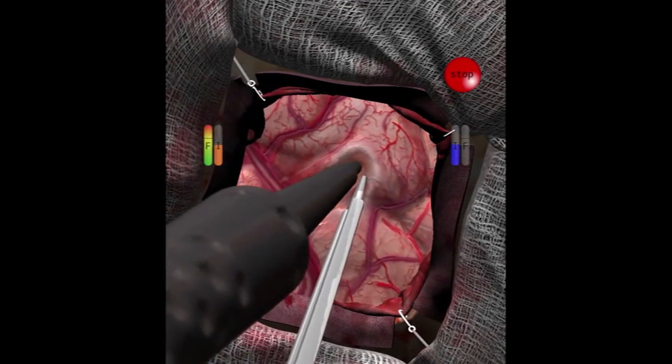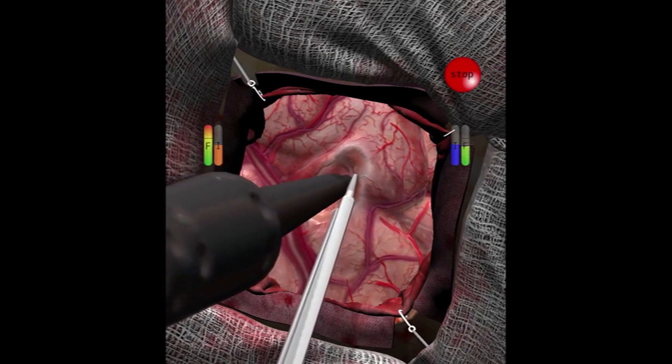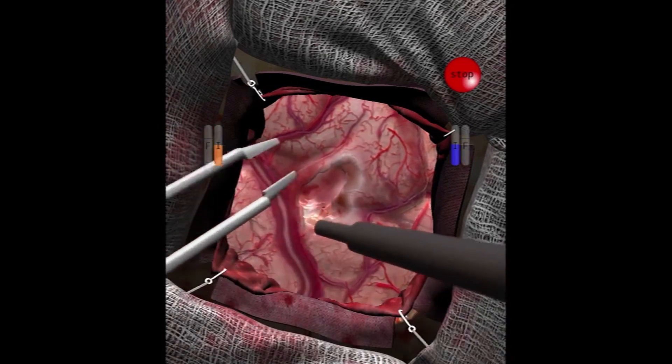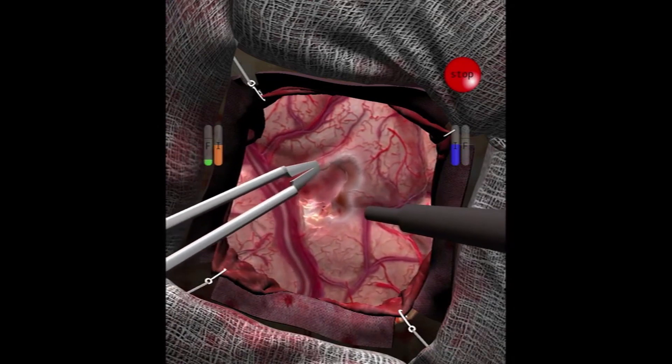After carefully removing the bulk of the tumor, this participant removes residual parts of the lesion and is notified to stop the simulation once 13 minutes is up.